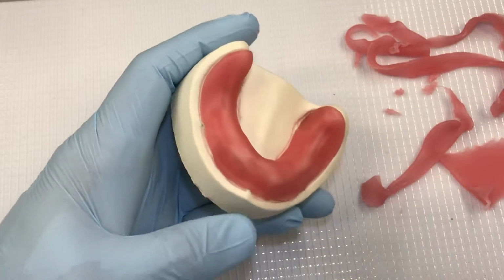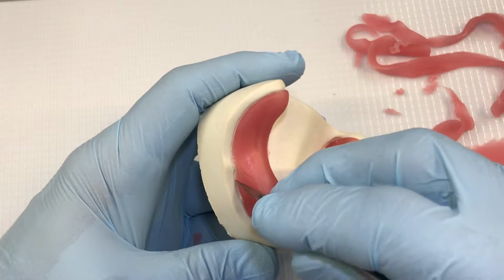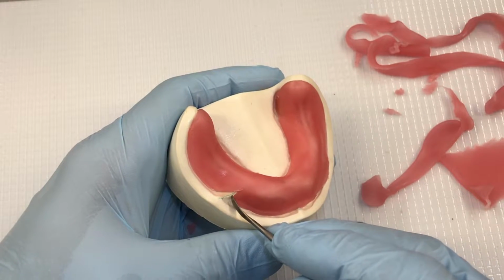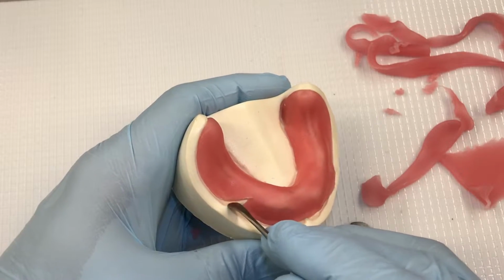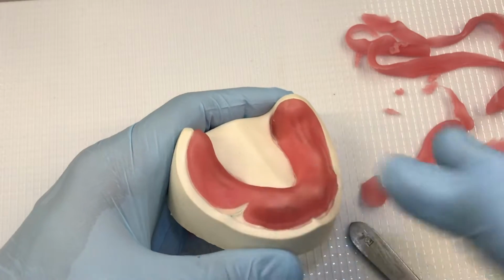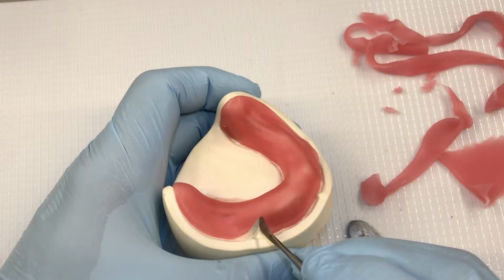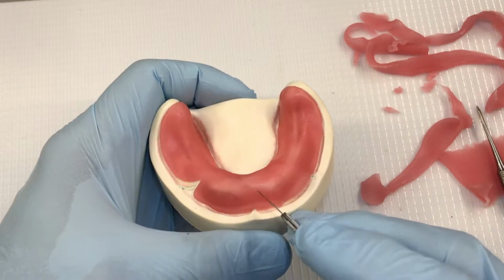And finally, we're going to clear the frenal attachments. I know these ones have a bit of a distal inclination, so I'm going to open it up like that. And at the same time, I want to round off this corner with my spatula and open up the frenum just slightly more. Go back and readapt to allow room for the wax to flow in there, because I want to create that clearance in wax as well. So a little more relief in the base plate and a little less in the wax.